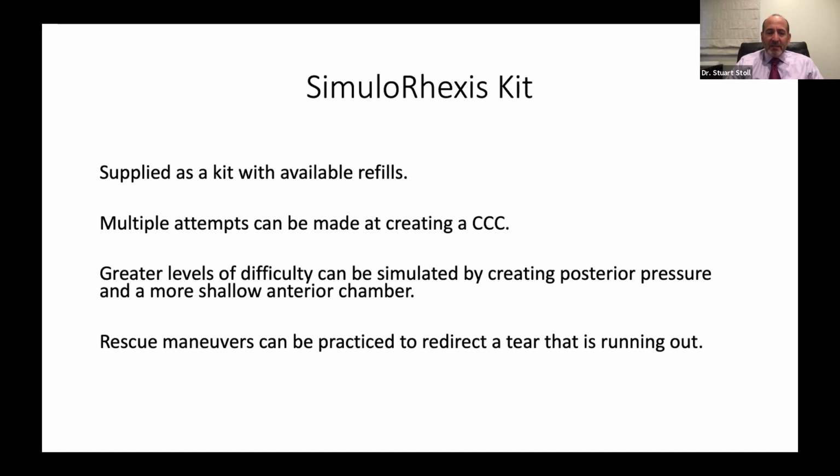So you can practice simple things like making incisions. You can practice the full rhexis. And you can practice more difficult scenarios, creating posterior pressure, shallowing the anterior chamber, and rescuing the capsule if it's starting to run out and get away from you.